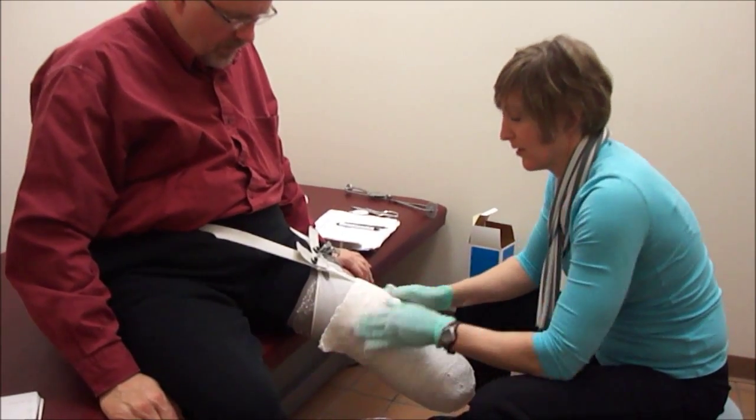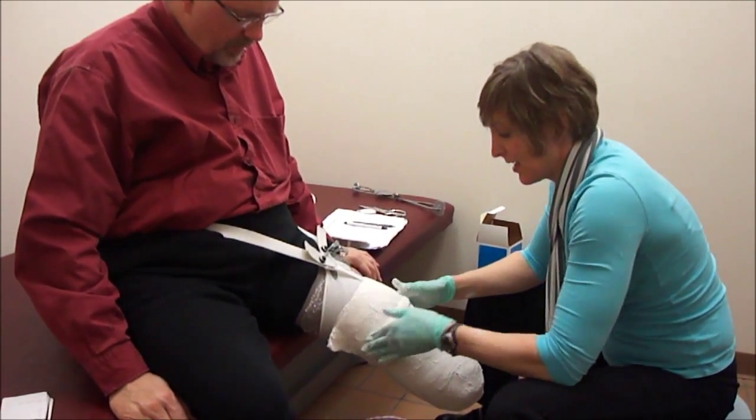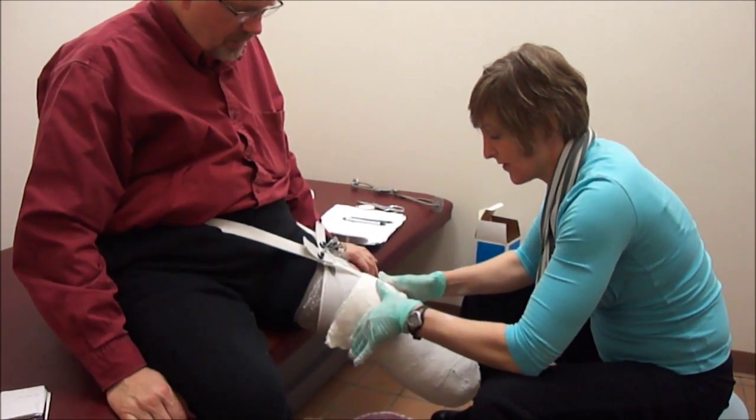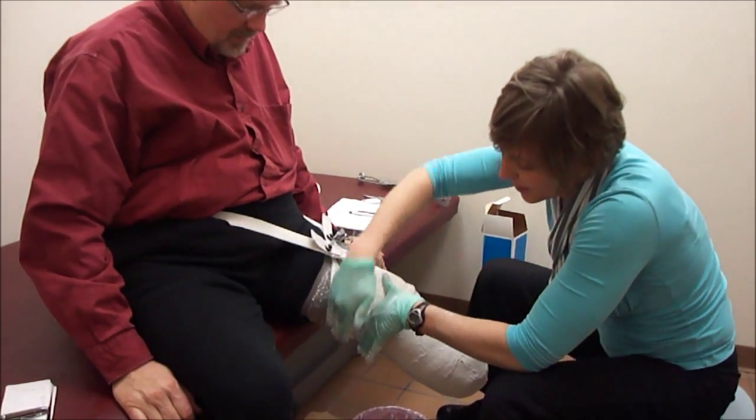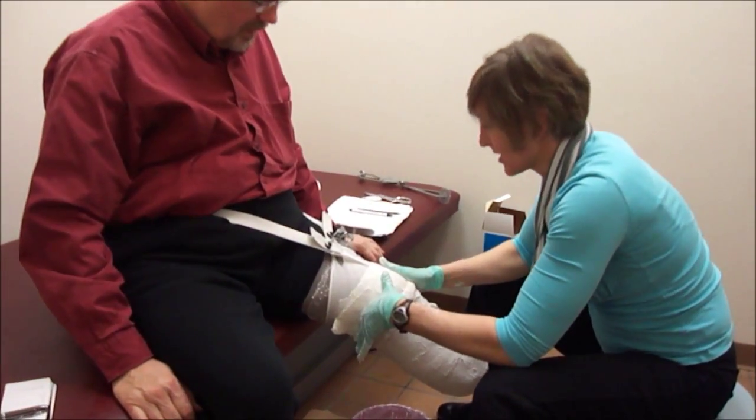I feel warmth now. Is that the plaster or is that the water that you put in? It's actually a combination. I am using fairly warm water, just because it helps the plaster set up a little bit quicker. But as plaster sets, it gets warm too. Oh, okay.